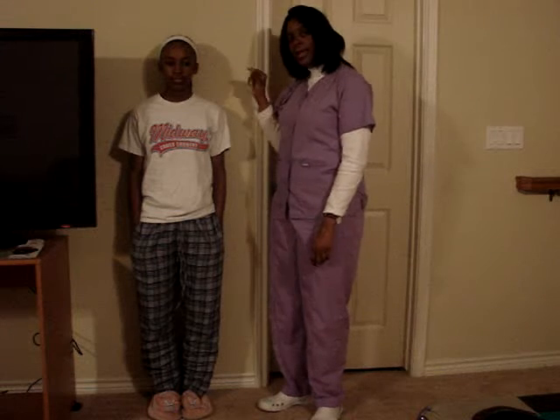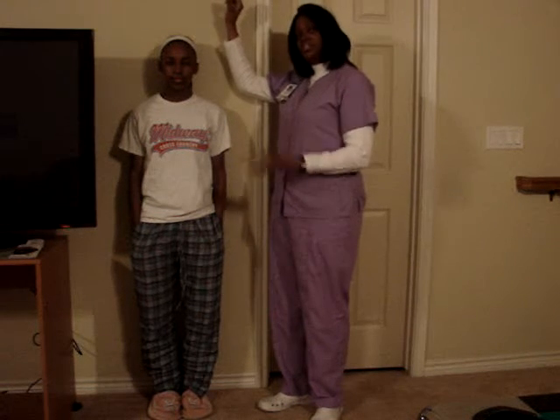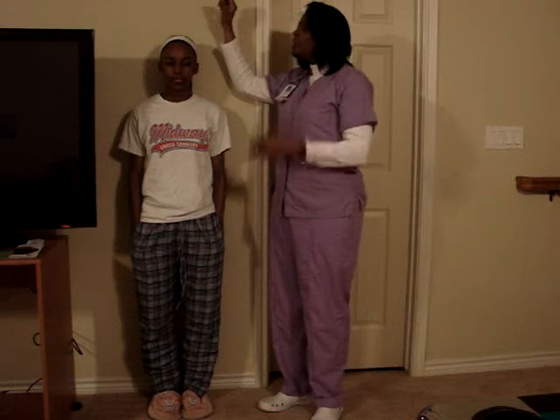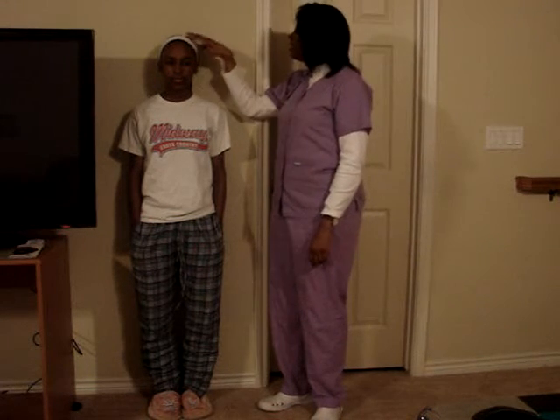To perform her height with one of those, I'd ask her to step off the scale so that I could take the height level adjustment and move it up. She'd step back on the scale, and I'd move that level down to the top of the crown of her head, and when I read that measurement, that would be her height.